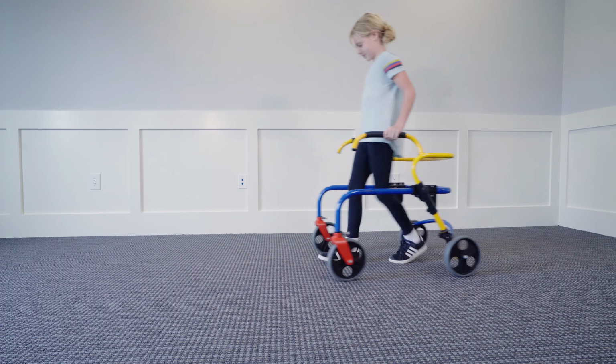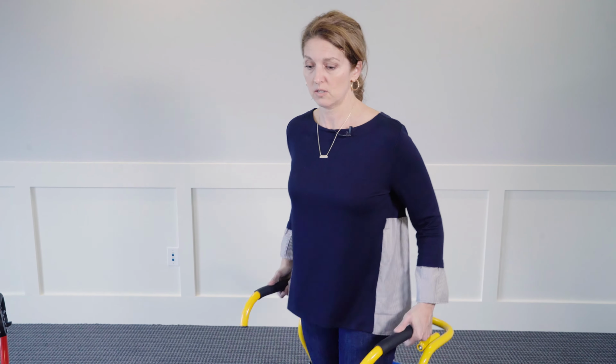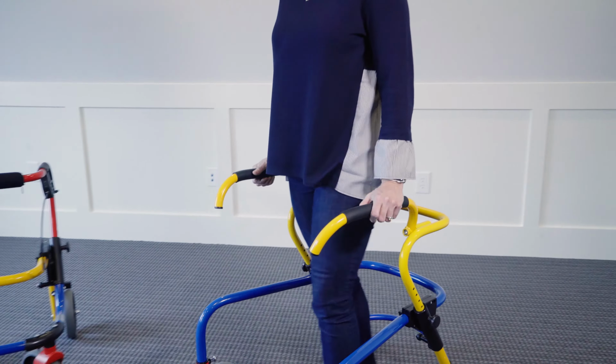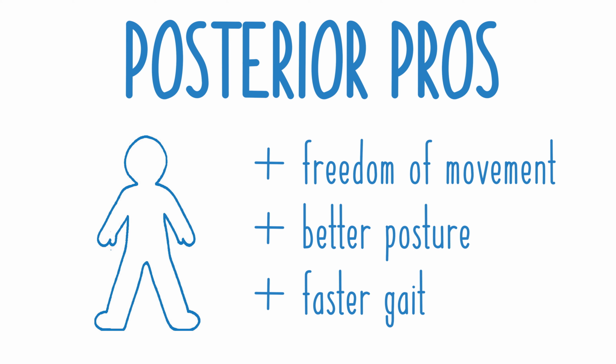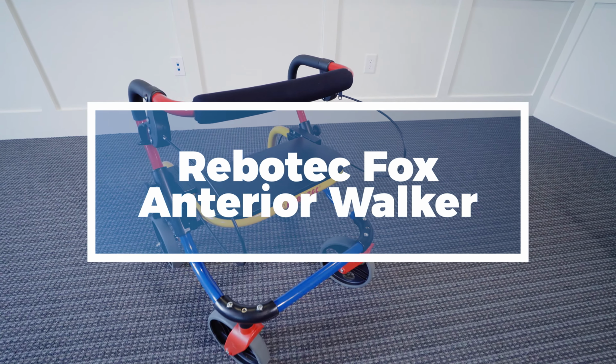Another reason to have a posterior walker is that you have better posture in it. As you can see, I can stand upright, it brings my shoulders back. They also can walk in these things super fast, so their gait speed is good, and it's a better long-term device for individuals that have a chronic long-term diagnosis such as spastic diplegic cerebral palsy, and all those neurological diseases that don't go away. Now we're gonna go to the anterior walker.